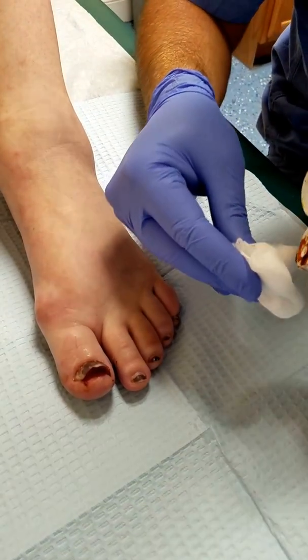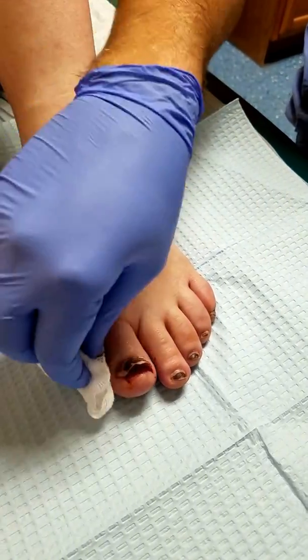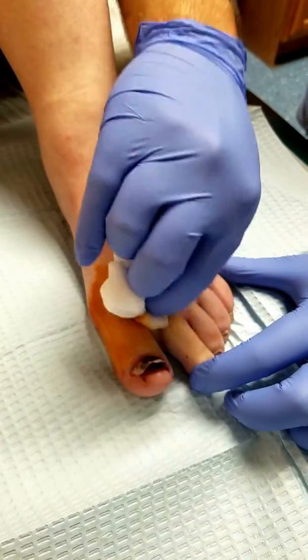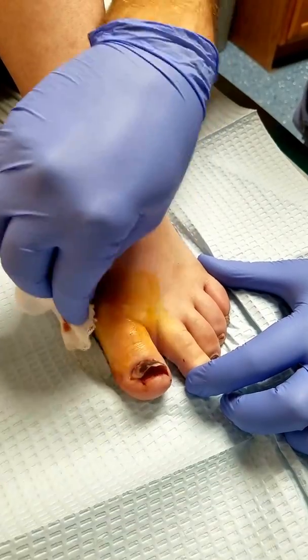First things first, we're going to get some betadine just to clean off the toe base so that we can give you the numbing medicine. Your whole toe should go numb. And you had stubbed this toe earlier today? Yeah, it was this morning before I went to work.